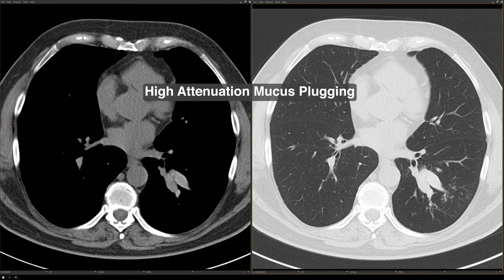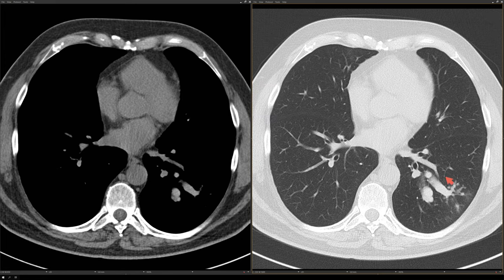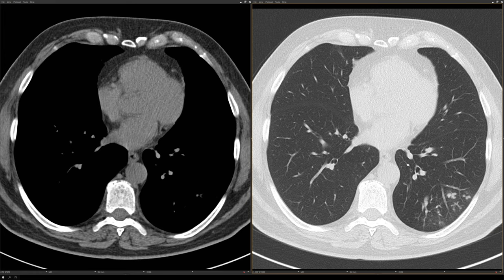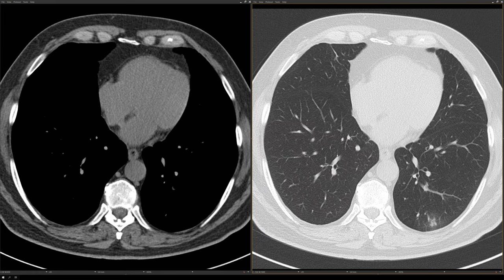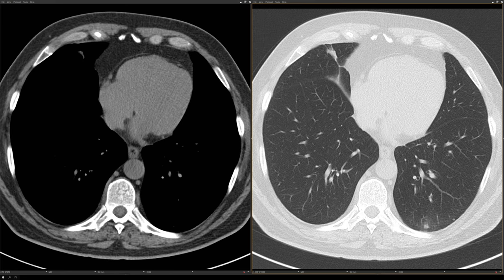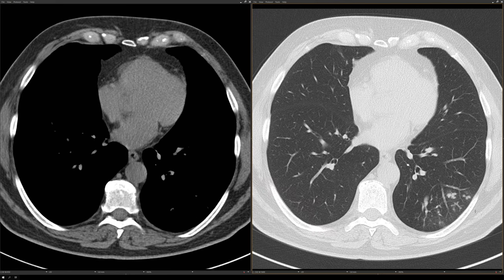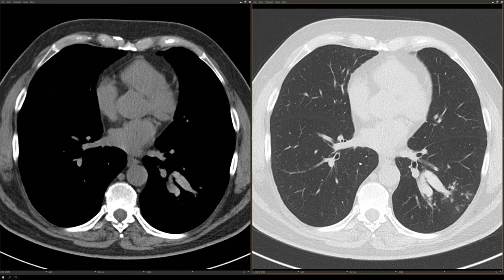If we continue to scroll distally, you can see that there are some areas of tree-in-bud opacity down here in the left lower lobe, distal to that central mucus plug. And then we have a little bit of ground glass opacity around some of those areas of tree-in-bud. So putting everything together, we have a patient with asthma, bronchiectasis, high attenuation mucus plugging, tree-in-bud opacity, and a little bit of ground glass opacity — all of these findings are consistent with ABPA.